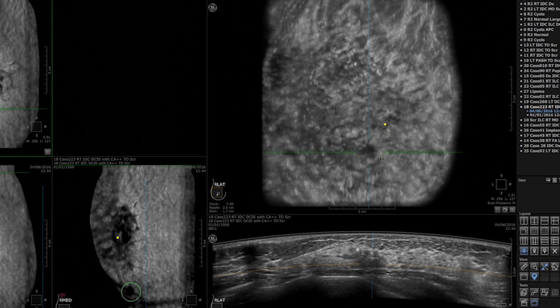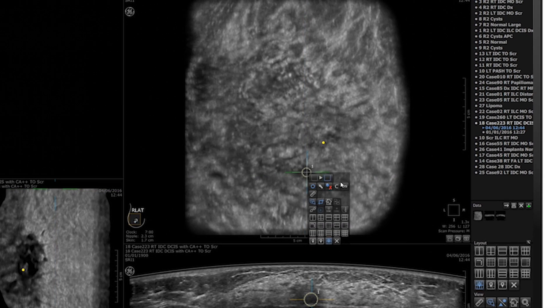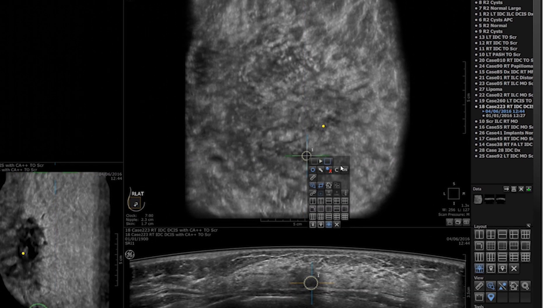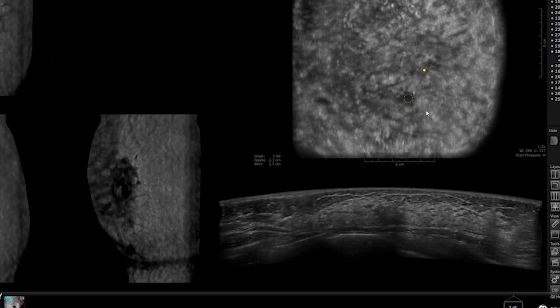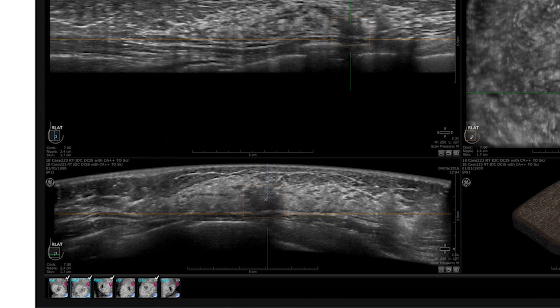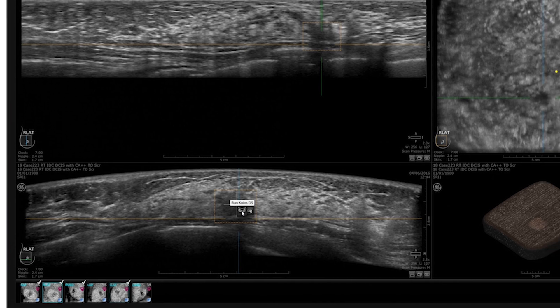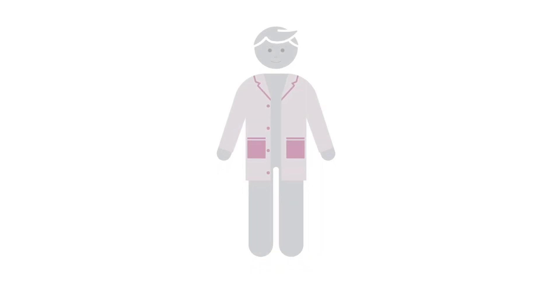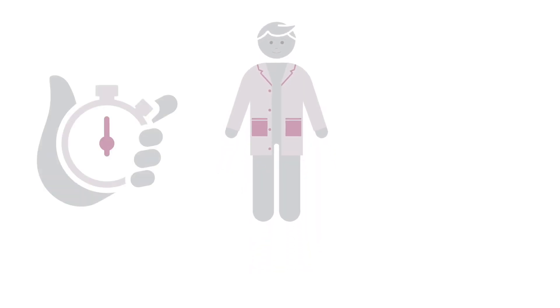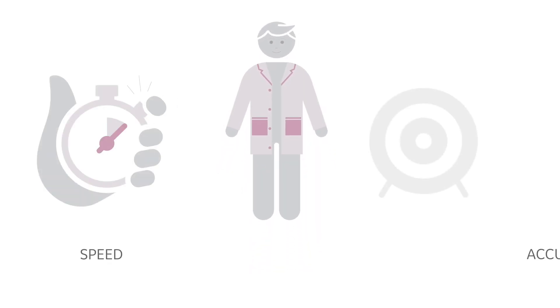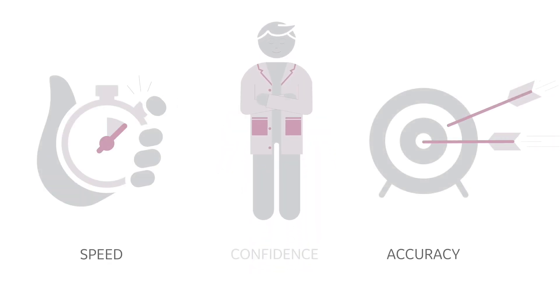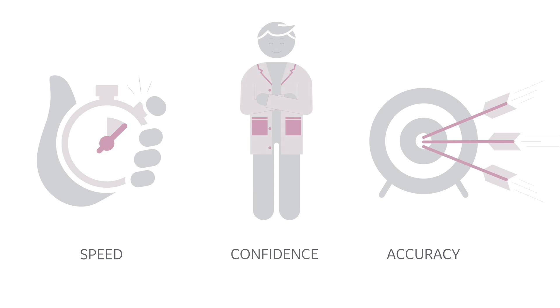The powerful AI assistant seamlessly integrates intelligent algorithms to assist in detecting and characterizing breast lesions, helping radiologists increase their reading speed with a great degree of confidence.